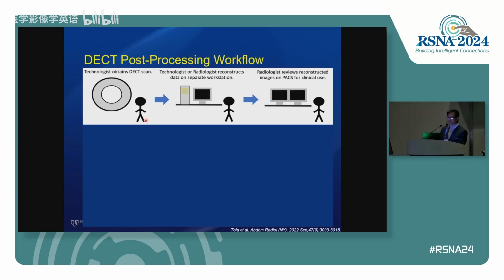So the data after the patient scan should go to an independent workstation where the dual energy CT images are post-processed, and then it finally gets to the radiologist to read. So that's one way that this can be set up.